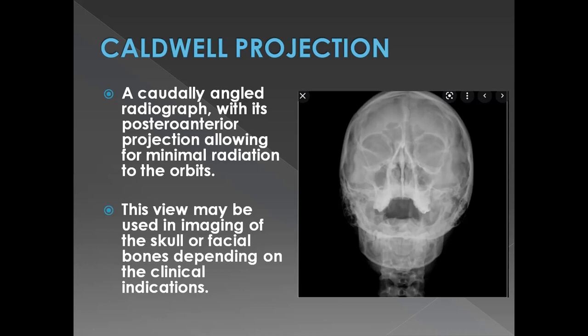One common question which is usually asked, and I thought I'll share it with you guys, is why are most of the maxillofacial radiographs always taken posteriorly? Like, why is every X-ray you order usually PA skull or PA mandible or even PNS? Why are all the X-rays taken in this direction?